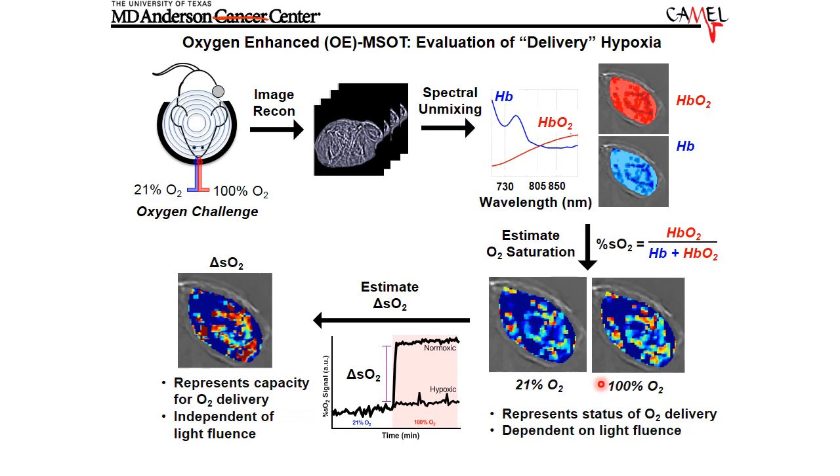And it's an interesting idea that you can actually see that there is a difference in this percent SO2 with these two types of carrier gases. And this is known as delta SO2, really championed by Sarah Bondic at Cambridge, and also Ralph Mason at UT Southwestern has done a very nice job really originating this idea as oxygen as a contrast agent.